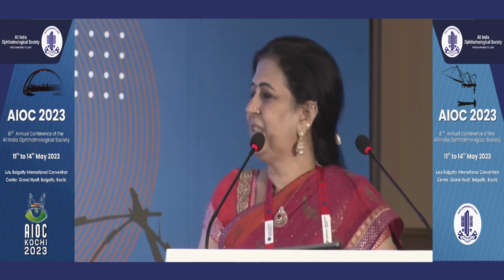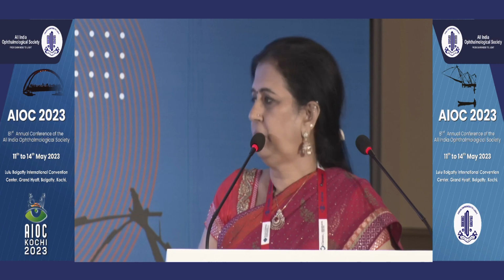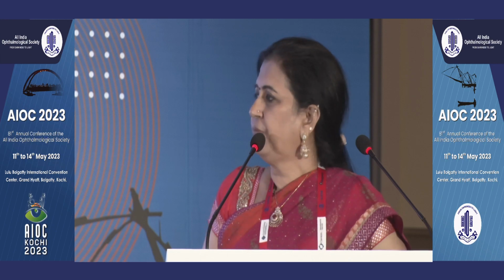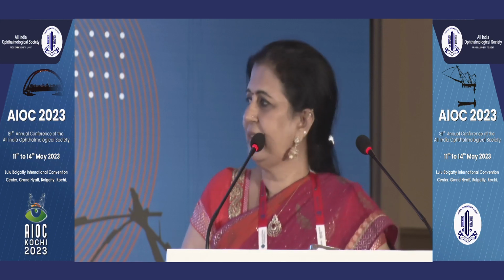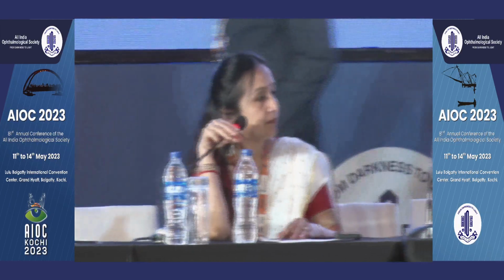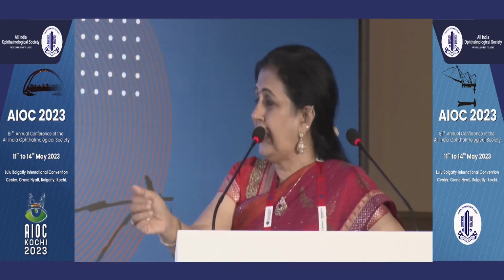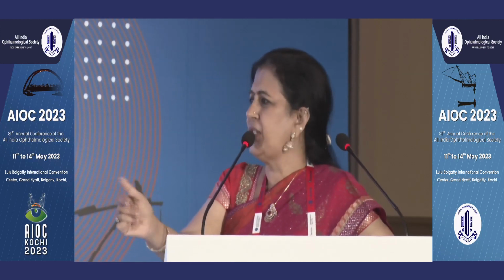Yeah, if you use the nomograms and then cyclotorsion compensation, we find that the results with SMILE are better than LASIK. The long-term results, because the stability of the astigmatic correction is better in SMILE than with LASIK. So that's what we have found. Yes, I'm sure. And not needing to make a flap, and also not depending on the surface ablation's healing response, I think SMILE would still score equally well. Actually, with the present ablation profiles, I don't think we have residual errors even in surface ablations, unless you transgress and treat too high a refractive error on the cornea. Each of these procedures is doing very well.